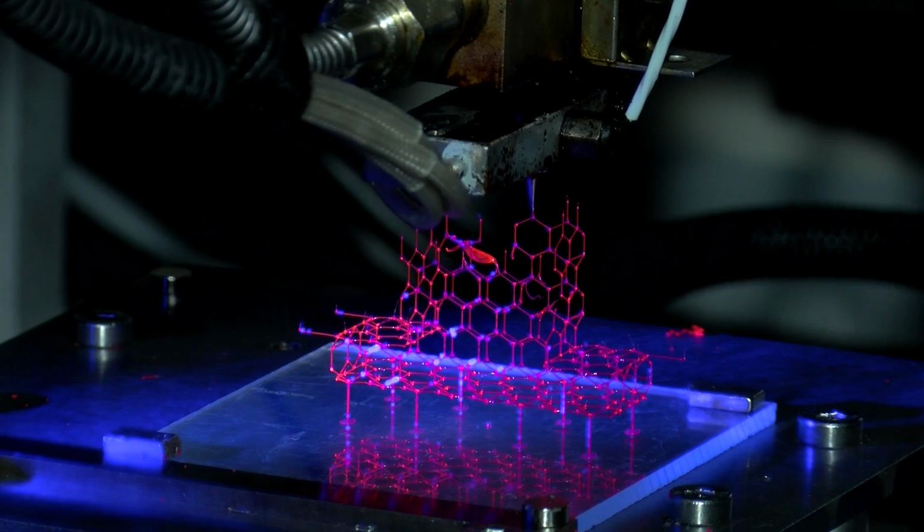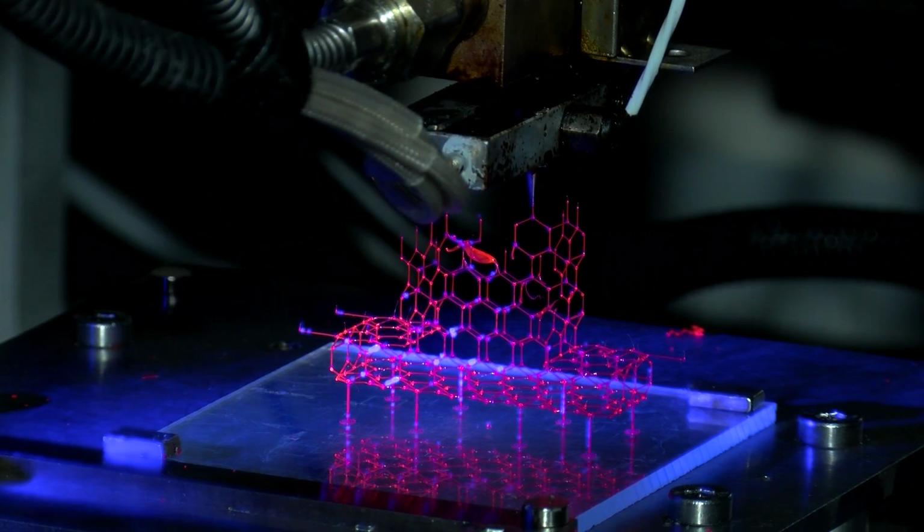At one end of this machine is, you might consider, a toothpaste tube. And we're applying a constant pressure, so we're squeezing material out of the toothpaste tube, except now imagine your toothpaste tube is heated. It can create something about as small as you can imagine.